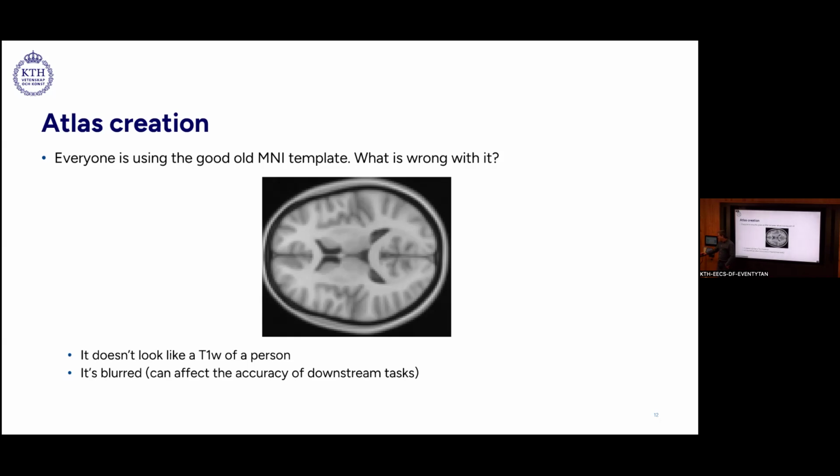But the main problem of this MRI template is that it's not age resolved. And that's actually what we want, a template that shows you the differences between different ages, and then use this information to generate the synthetic images.